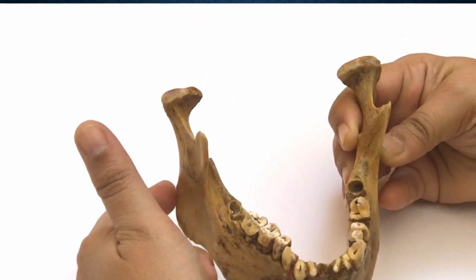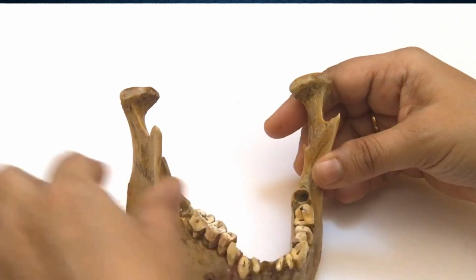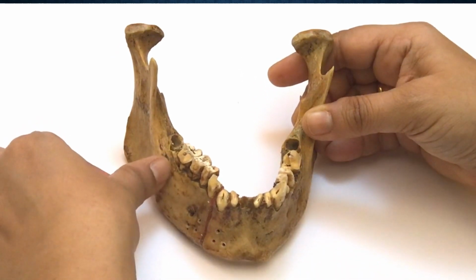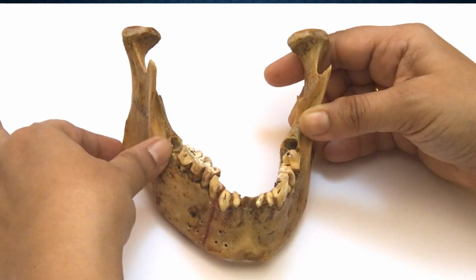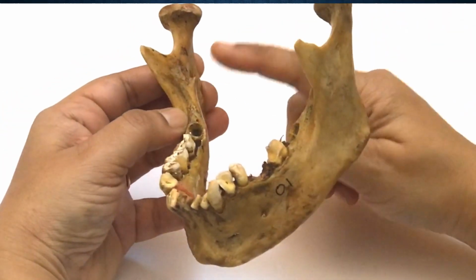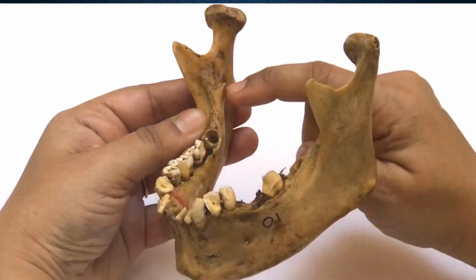That is the posterior surface of the ramus of the mandible. We need to identify the coronoid notch. To identify the coronoid notch, we place our thumb on the anterior border of the ramus and pass it up and down the external oblique ridge and the anterior border of the ramus till we come to the deepest part of the anterior border, which is called the coronoid notch. With the finger in the coronoid notch, we place the remaining two fingers on the posterior surface of the ramus. This gives us an estimation of the width.